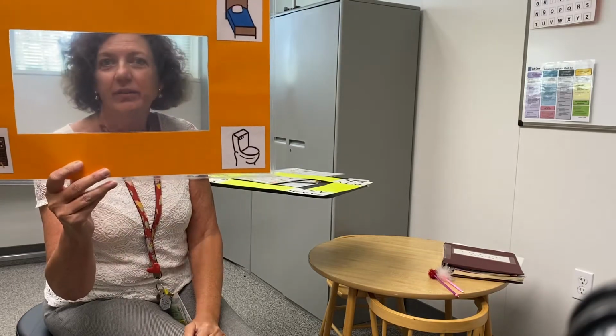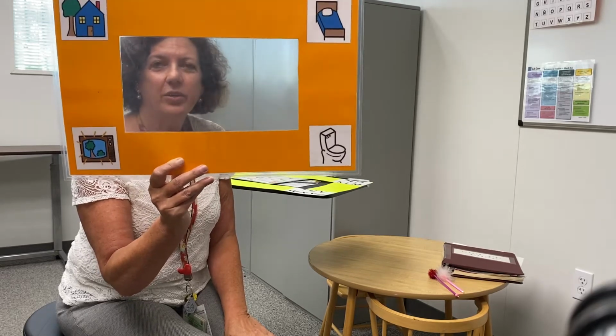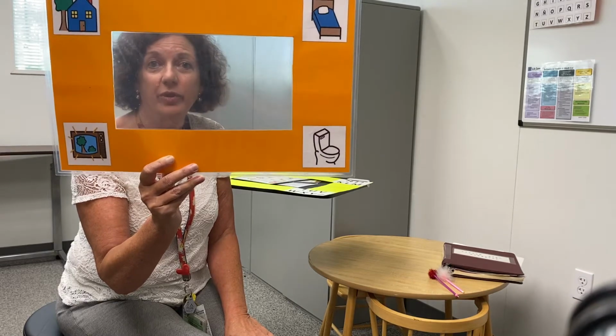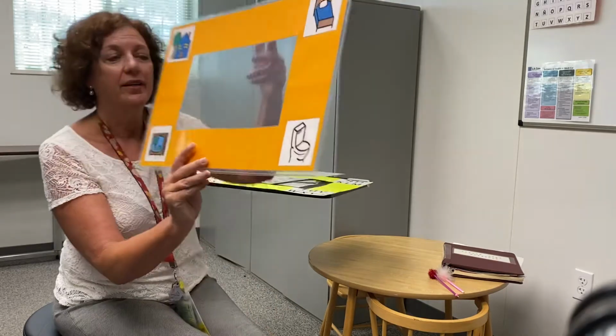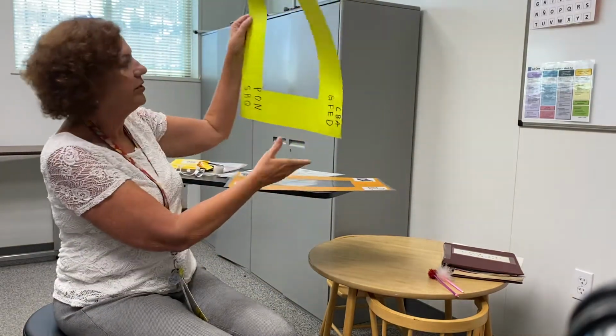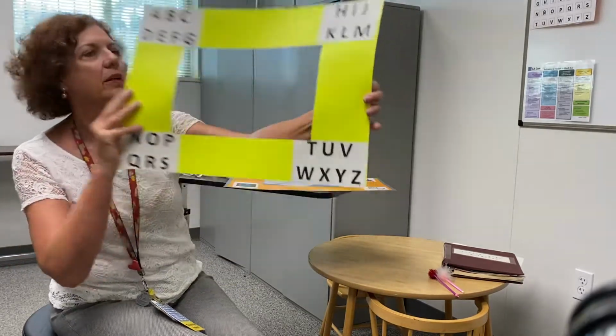And I can see through here what you're looking at. So this is also a good way in terms of evaluation to determine: can they move their eyes to make a choice? Can they show me what they want with their eyes? This can also be used for spelling a novel response.